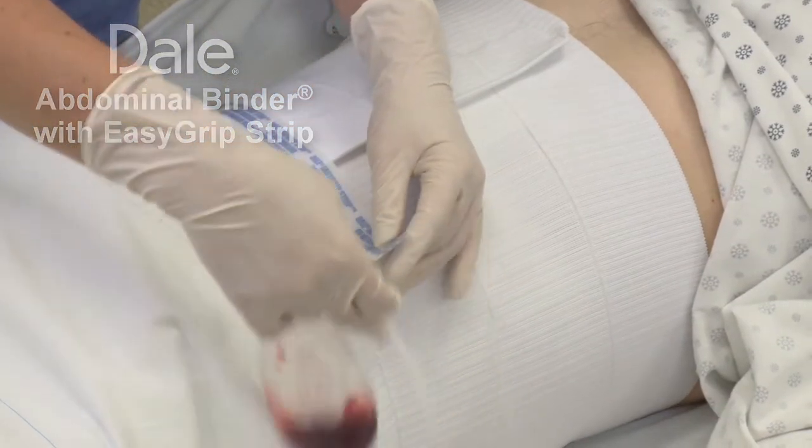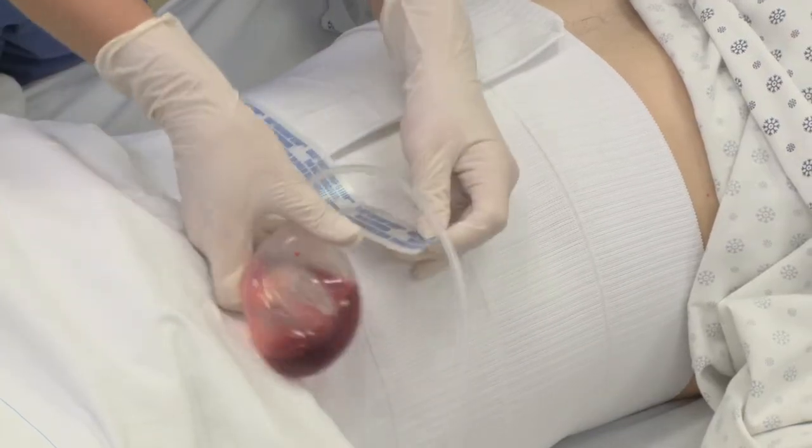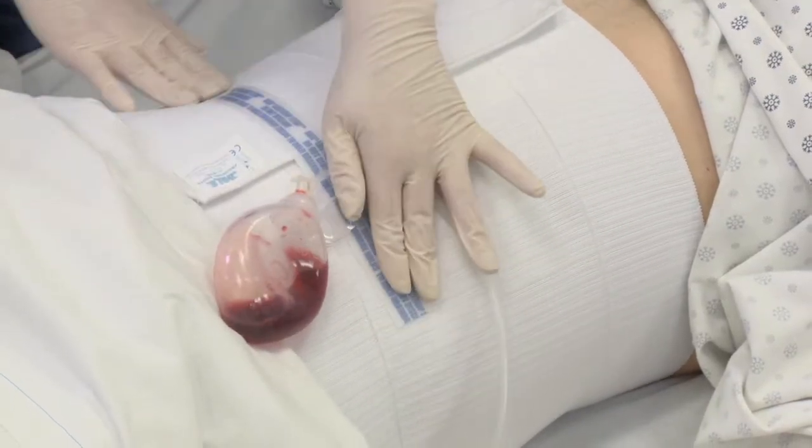The Dale Abdominal Binder with the Easy Grip Strip is ideal for holding wound dressings and accommodates the use of peg tubes and drainage tubes.